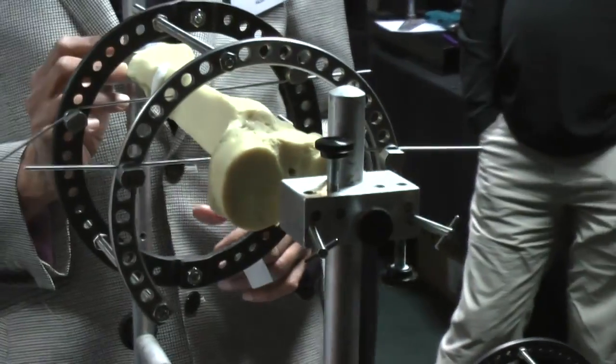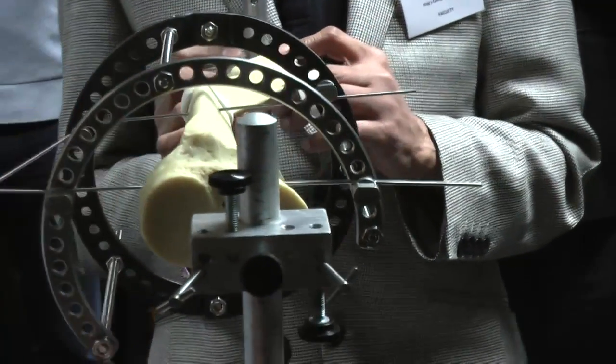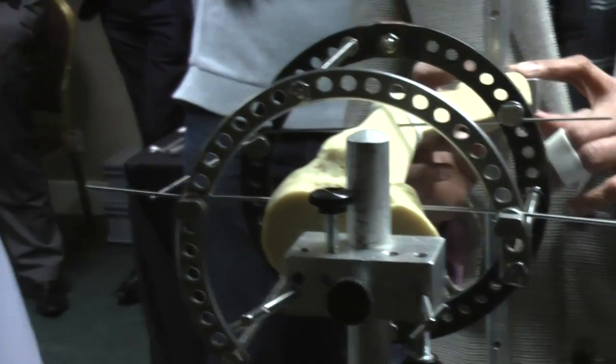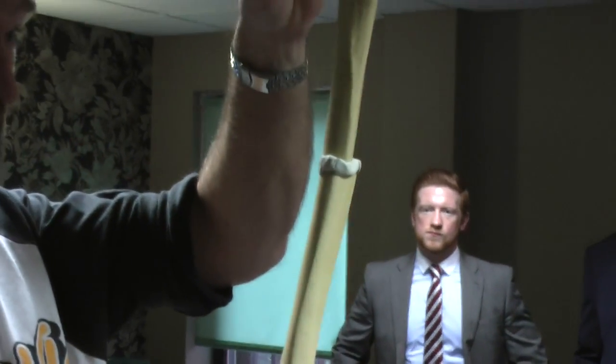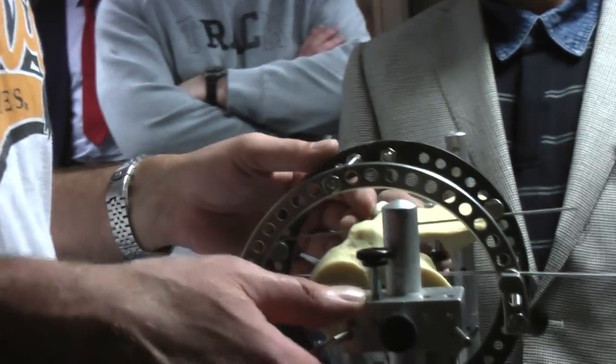I'm just going to chuck the sharps underneath. Now, remember what we said earlier? When you look at this thing, there is a point at which you can make it look straight by twirling around the image intensifier, which means there's also a place 90 degrees away from that where it is maximally deformed. Yeah? We agreed? You can do exactly the same thing with this thing now.